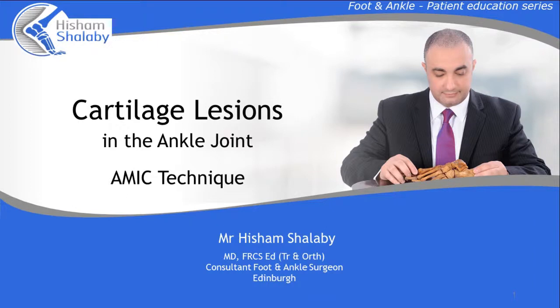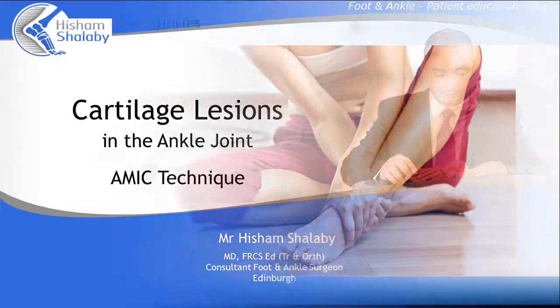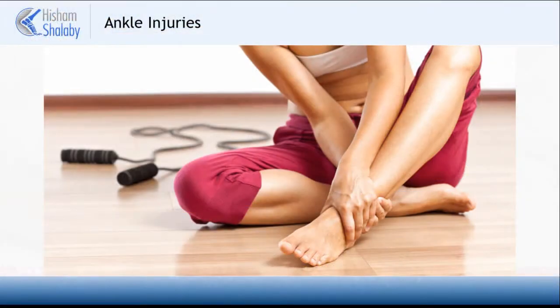I will speak in this video about the surgical management of cartilage lesions within the ankle joint. I will focus in this video on large lesions and their management with a technique called Autologous Matrix Induced Chondrogenesis, or AMIC for short.